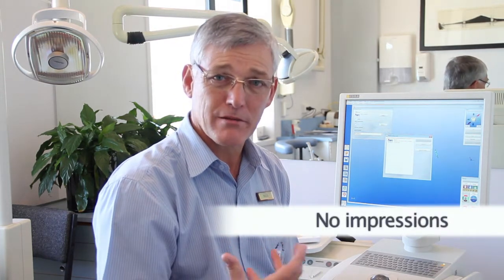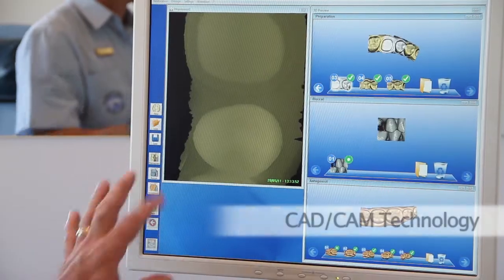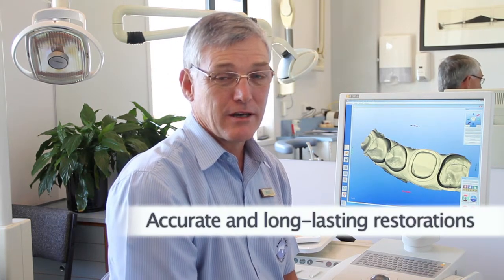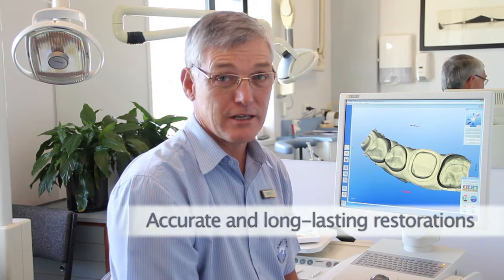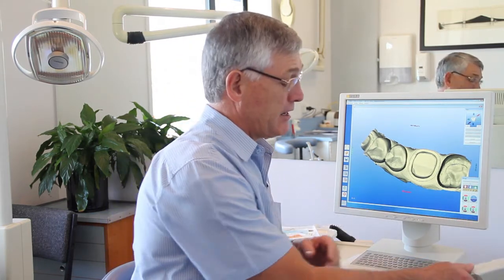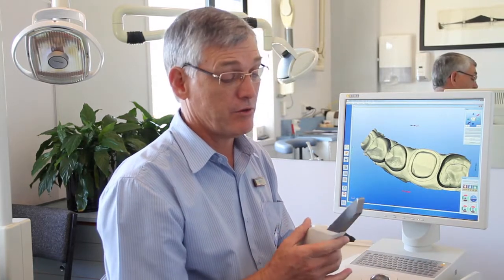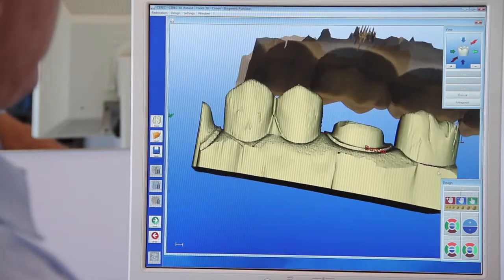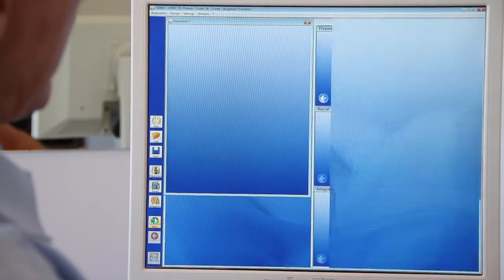You don't have to have impressions in your mouth. You don't have to have temporary crowns in your mouth. We take the optical image and we manufacture the restoration on site. CAD-CAM is a really accurate, quick method of producing one of the most accurate and long-lasting restorations that we can do in dentistry these days. It relies on getting a very accurate 3D image of the mouth using a camera that fits in the mouth, and the computer uses all of this information to generate the models.